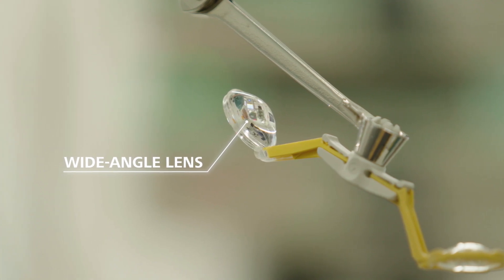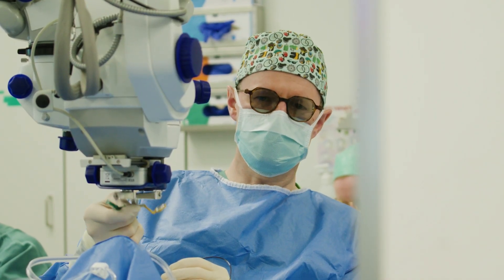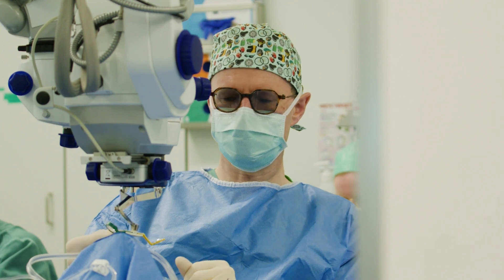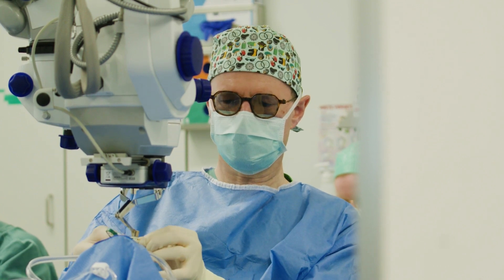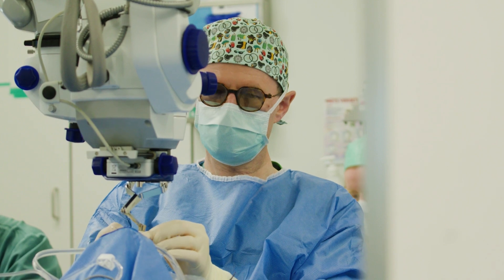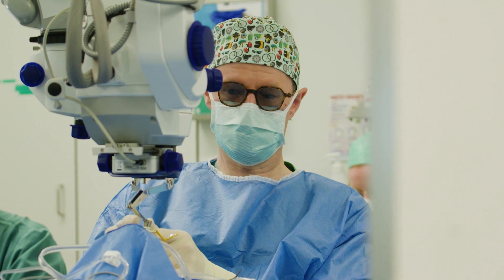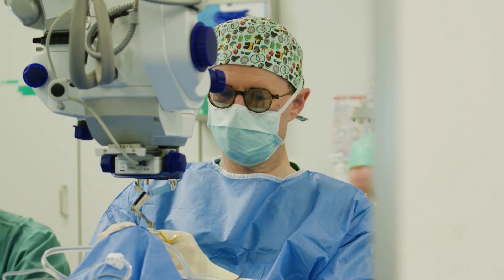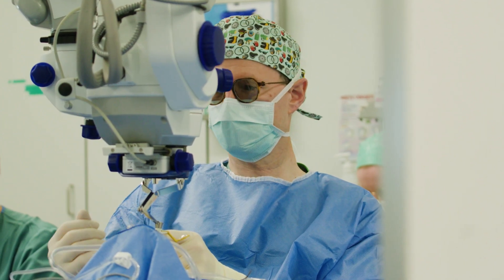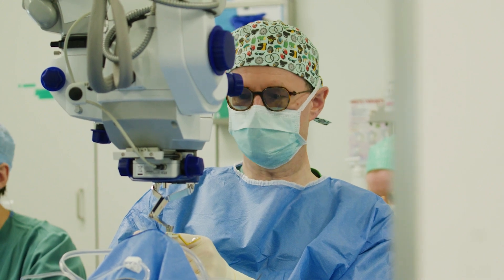What you have here is the traditional reusable ReSight system — the standard 128 diopter yellow reusable lens. And on the other side, this is a new version of this lens. There are some differences. First of all, it is disposable, and because of that reason you always have a perfectly clean optical surface, because you will not have scratches, patches, or tearing from reprocessing.